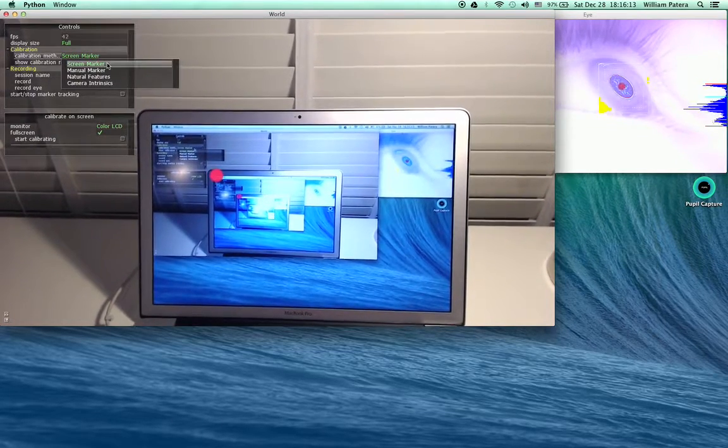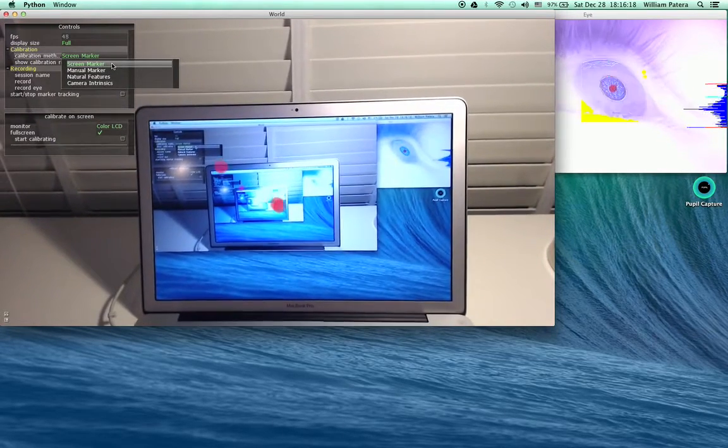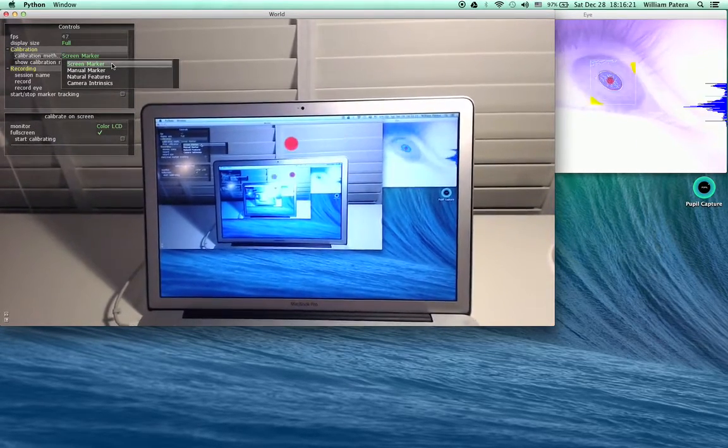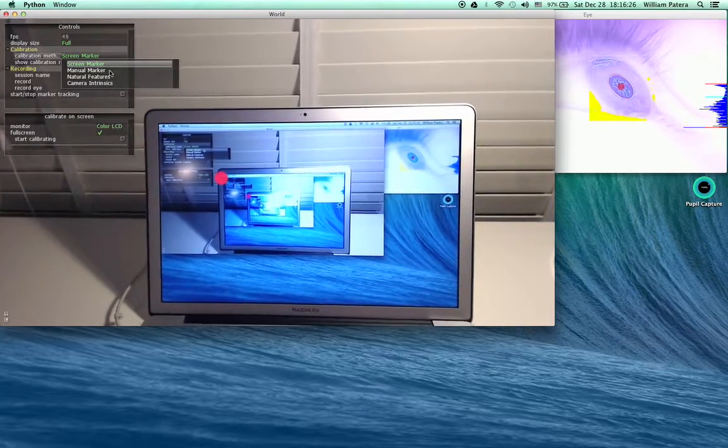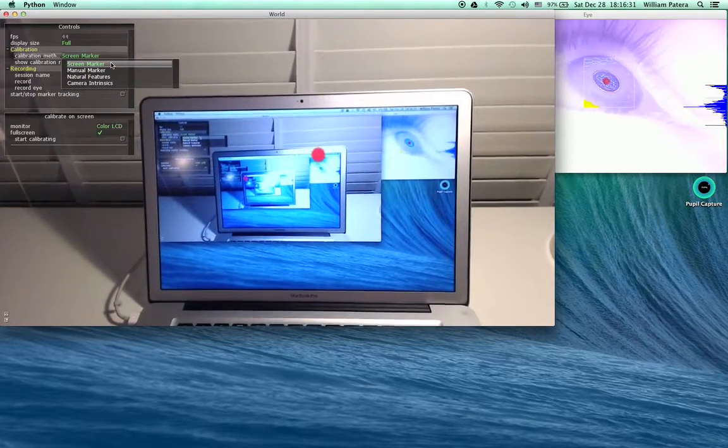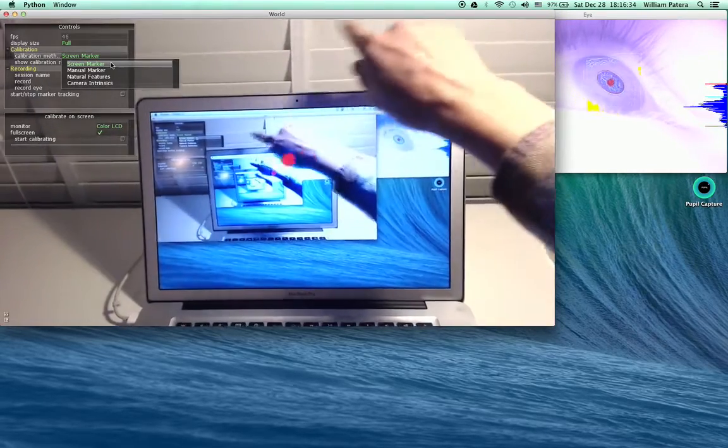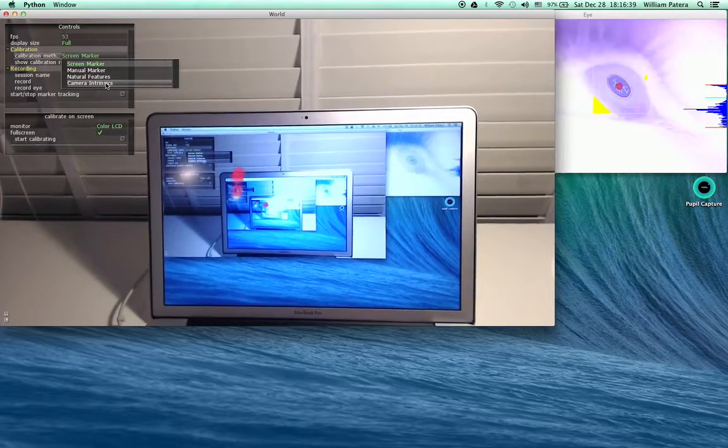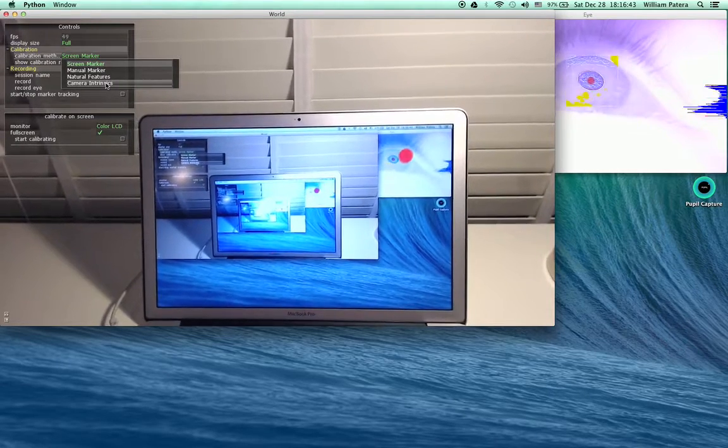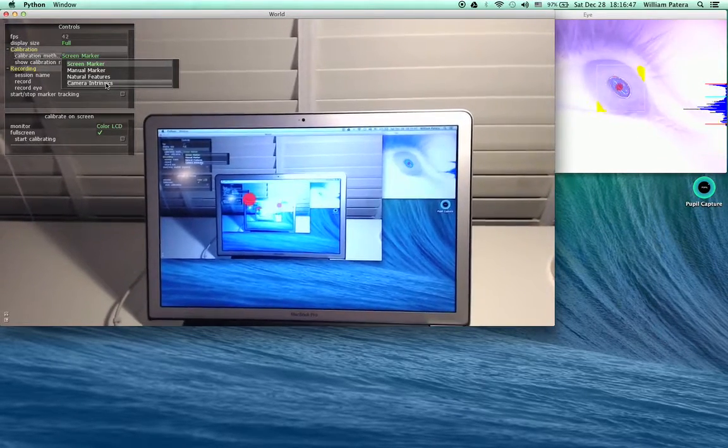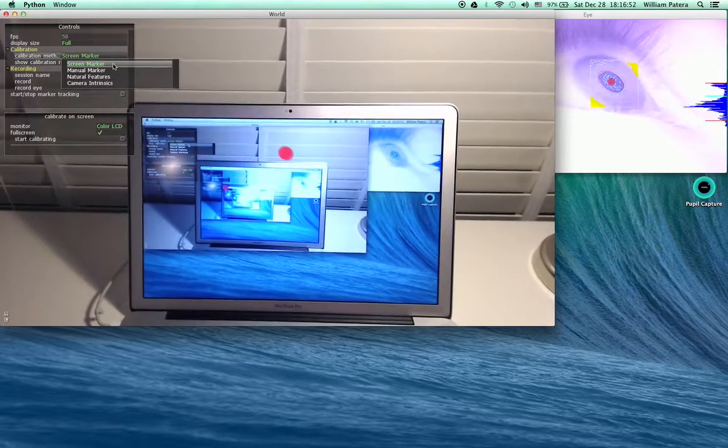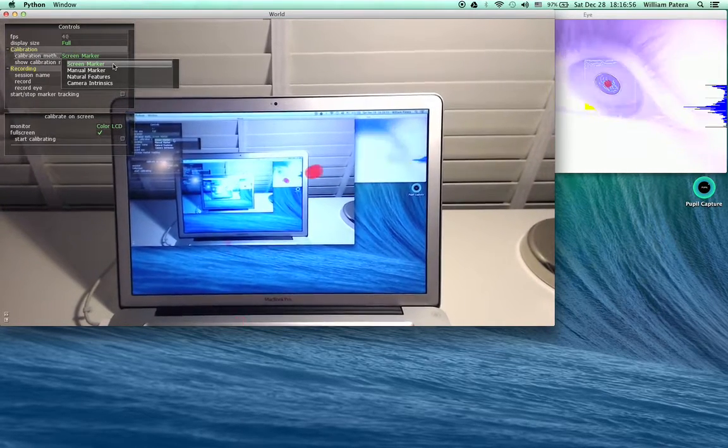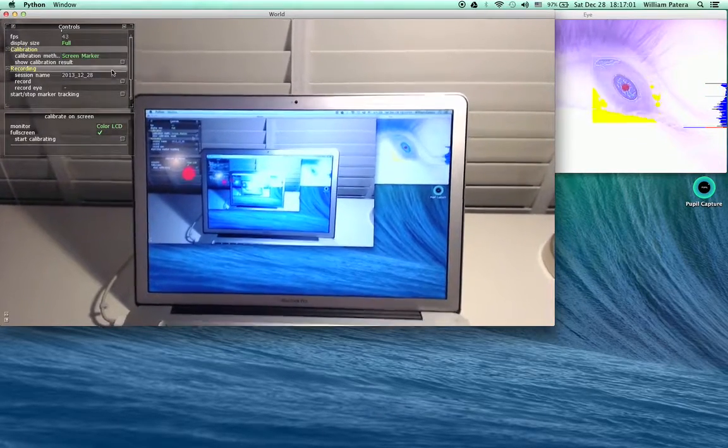Next we're going to calibrate with the screen marker. There are different ways to calibrate. Manual marker uses a marker you can move around in the environment. Natural features is an experimental method where we use features in the actual environment around us, so you can click on them with the mouse. Camera intrinsics is not a calibration method for eye tracking, but for the world camera that you may want to use if you're rectifying the image or doing other estimations later.